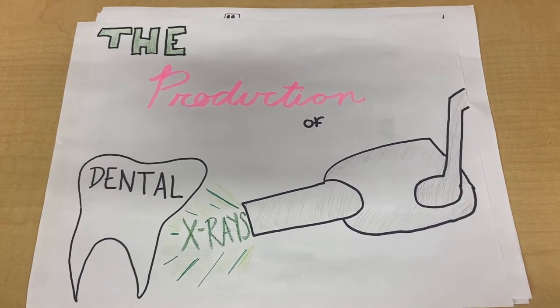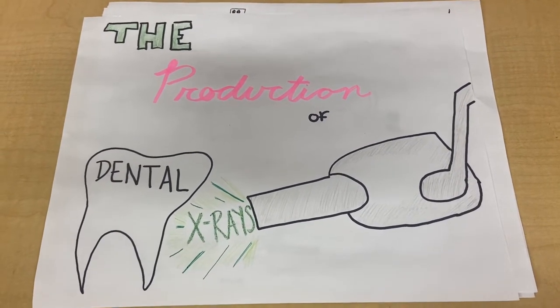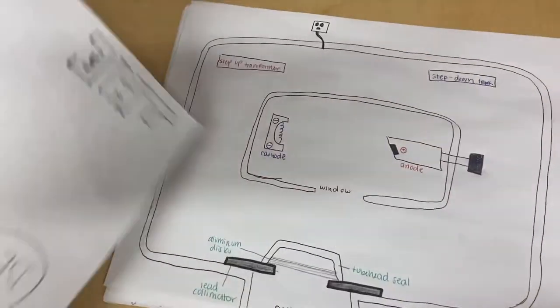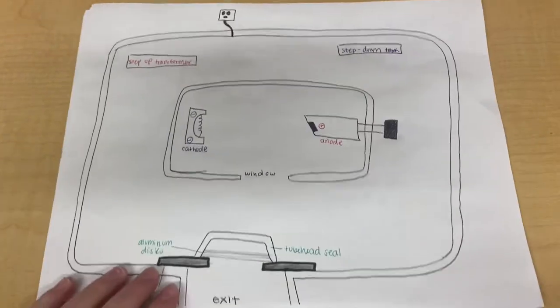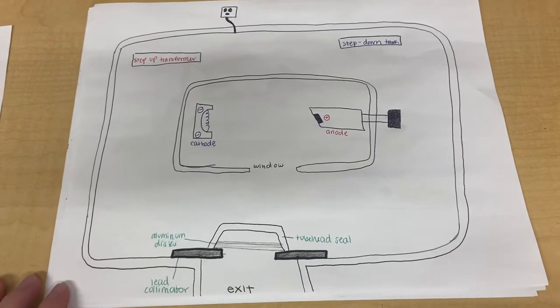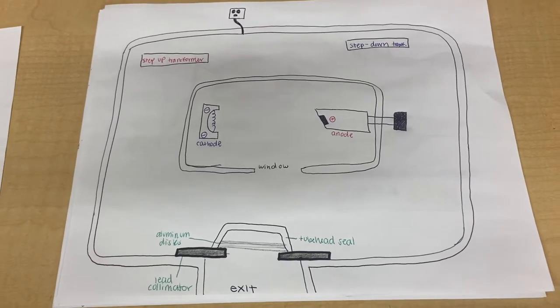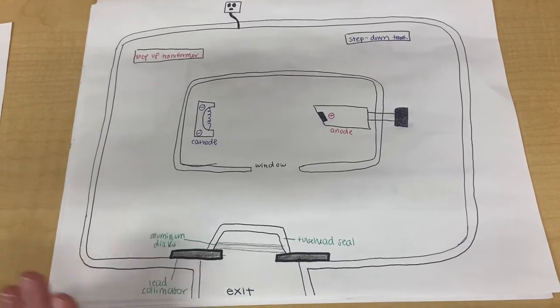Today we are going to be talking about the production of dental X-rays. I will be referencing this diagram because this is just taking a look inside the tube head in case I need to reference something.